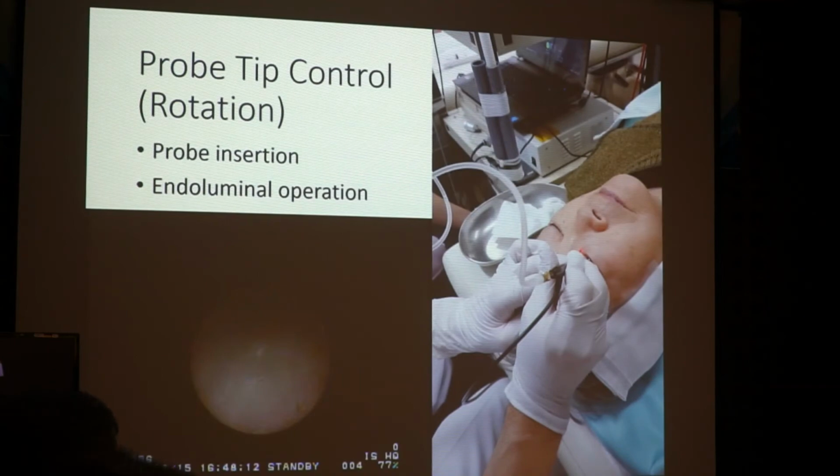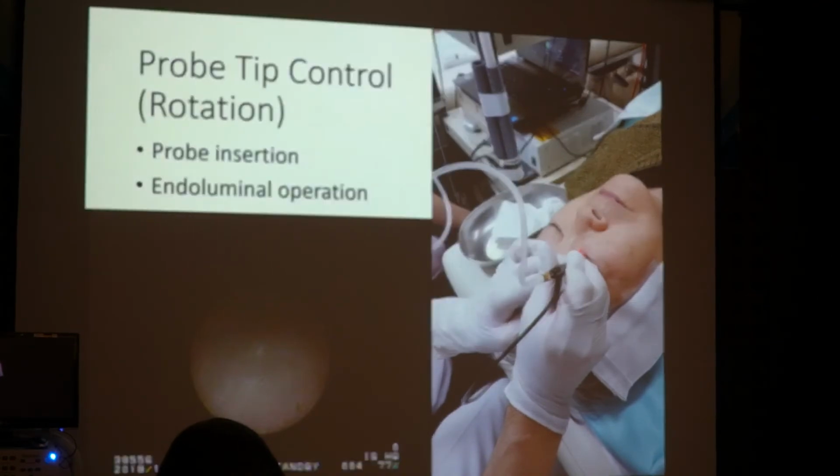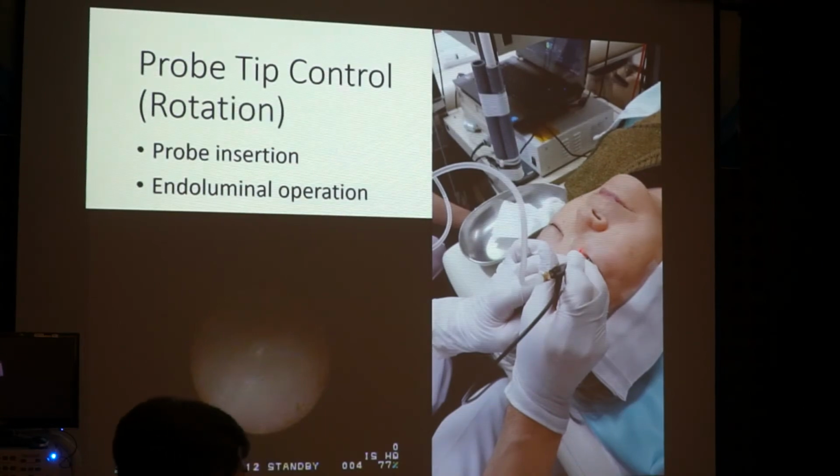When you perform duct examination, please use the upper punctum. The upper punctum is very useful for getting into the lacrimal sac. Through the inferior punctum, it is very difficult to get into the lacrimal sac. So please use the upper punctum.